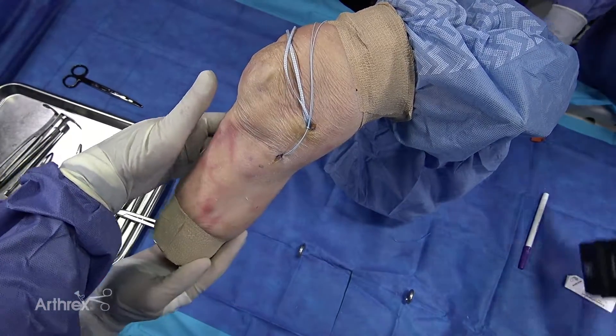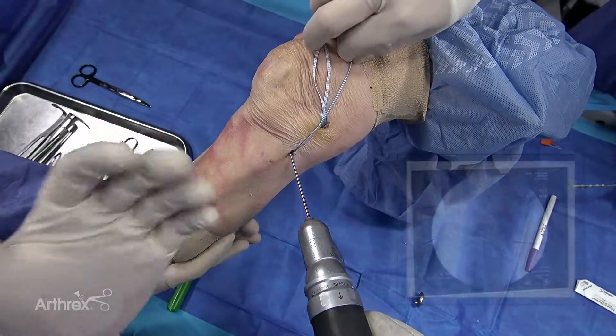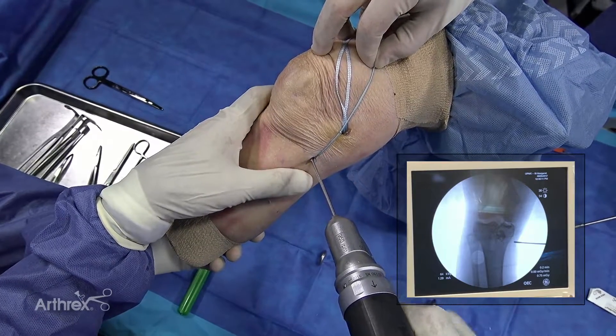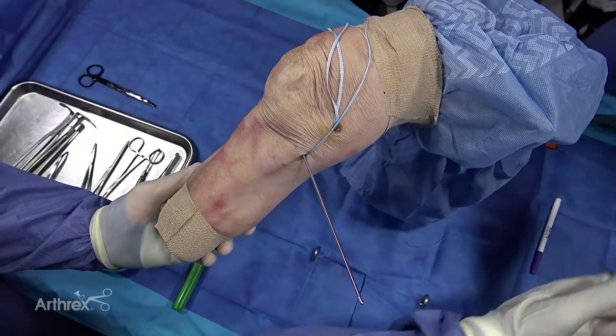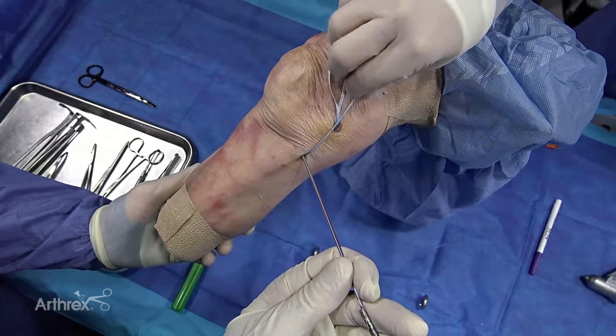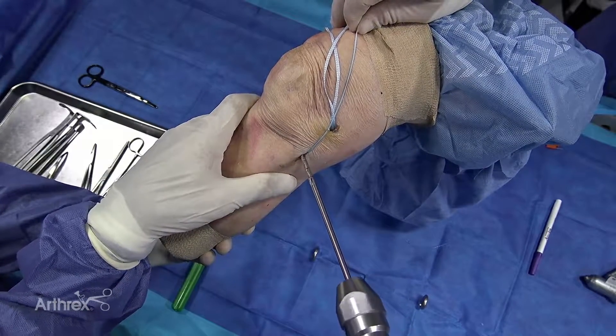Now the next thing you want to do is you want to insert your distal one, so you want to pull up on this so it doesn't get caught. Under fluoro control, I'm going to know that this is about two centimeters below the tibia, and I'll drill my hole. And then just like above, I'm going to use a drill and place the drill for my swivel lock.